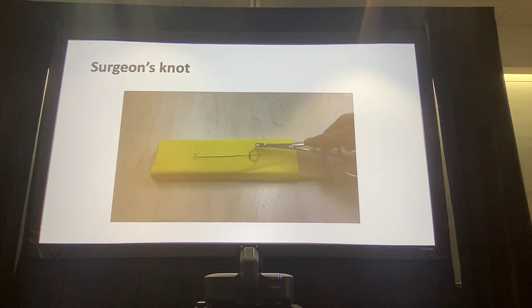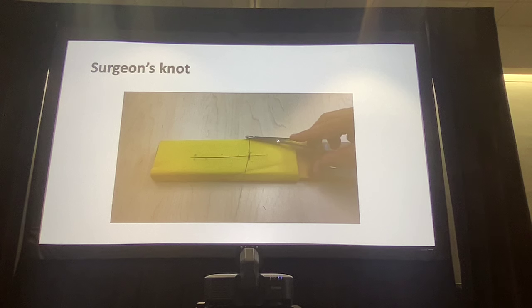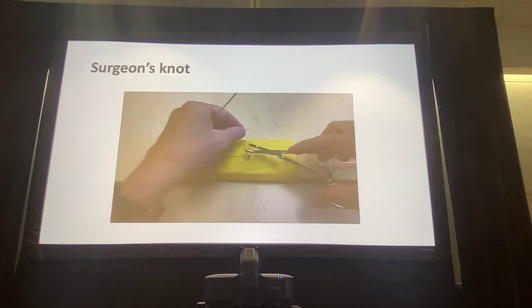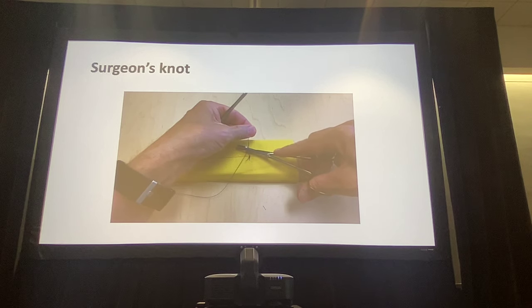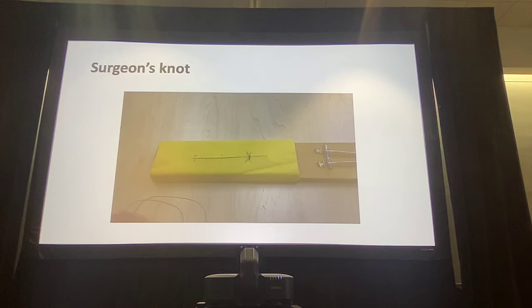Oh, by the way, you guys can maybe avoid the widest groove in here, the one at the end. Try to avoid the groove at the end of this. We'll use it later on. So try to avoid that if you can. It is not a big deal if you're ready to place suture. There's always room with suture. But the one at the very end, we're trying to save for later on. I do the surgeon's knot.